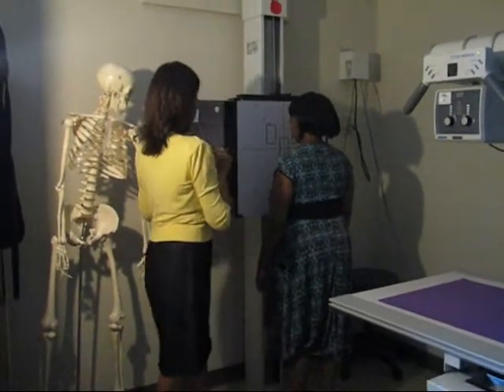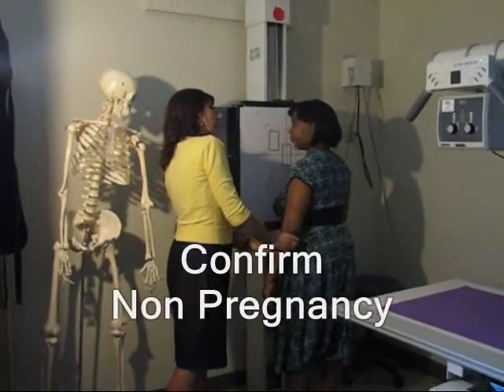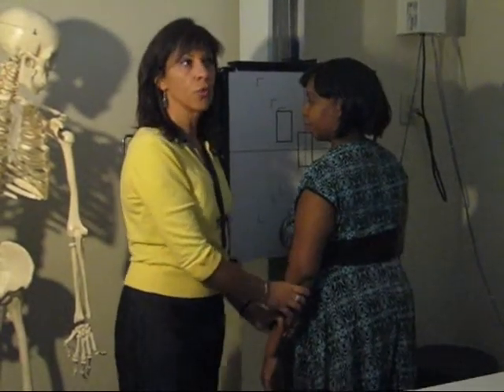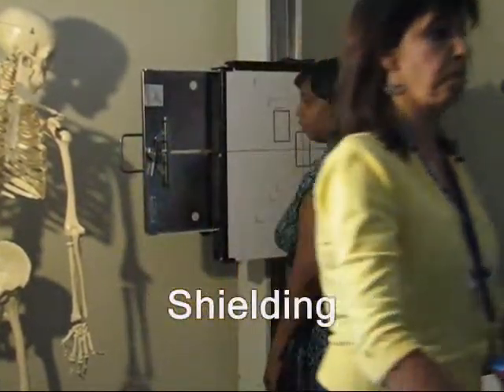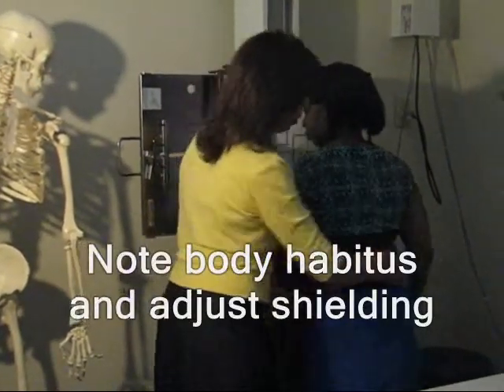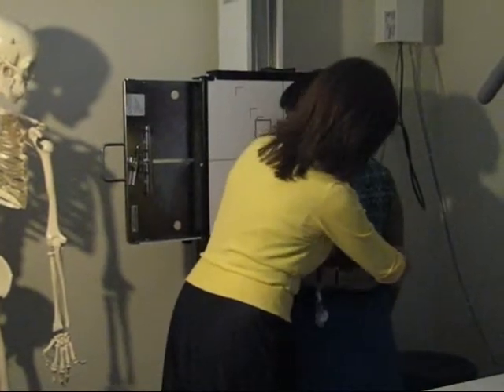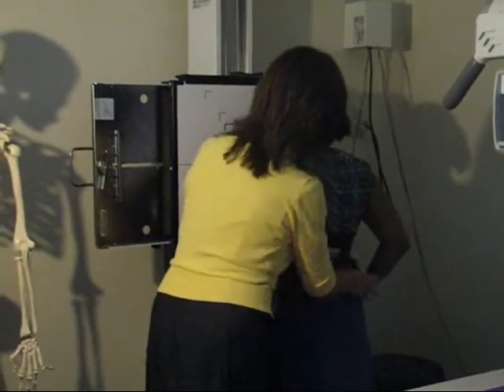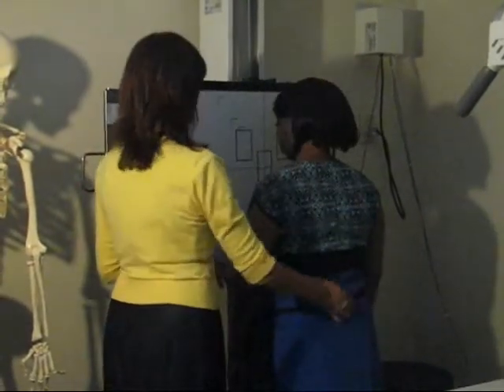So the first thing we're going to do is ask our patient, any possibility of being pregnant? No, there isn't. And we're going to shield our patient. Not too high, because some people have their costophrenic angles quite low, so you don't want to risk cutting that off.